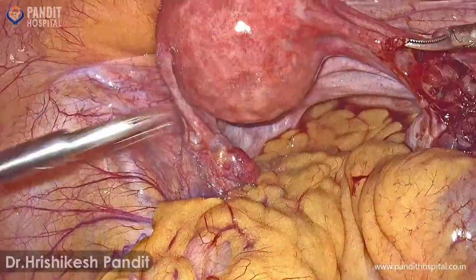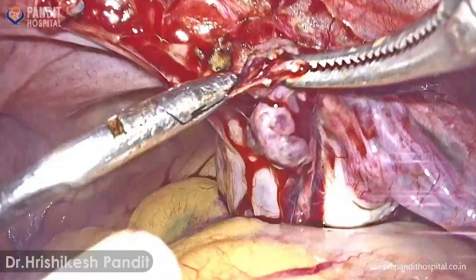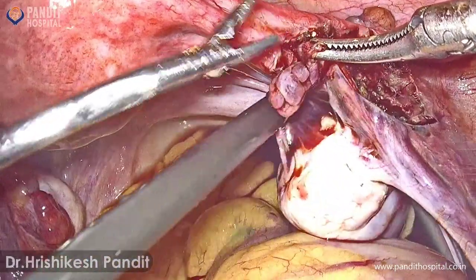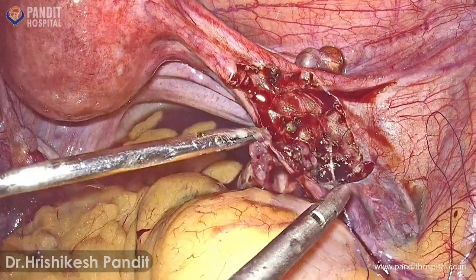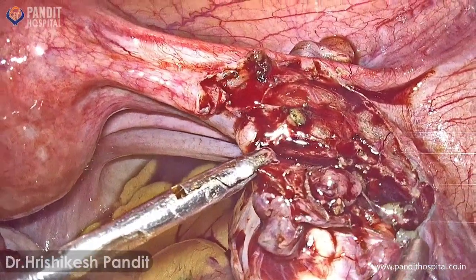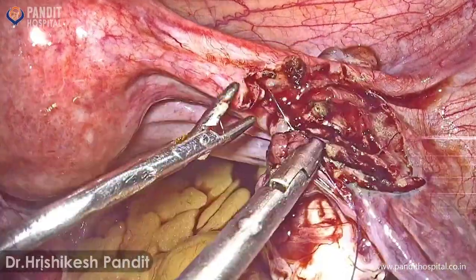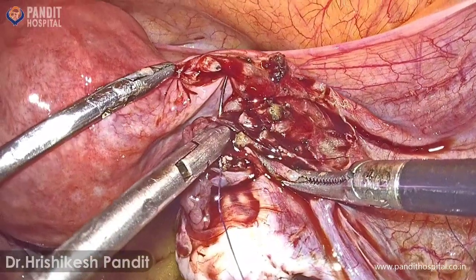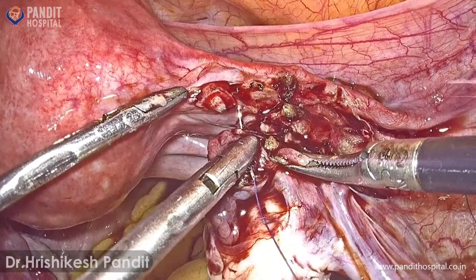As this distal end is quite short, I am not going to check the patency of this end. We will check the patency of the proximal end. When checking patency, the methylene blue should be concentrated so that it stains the mucosa of the tube, which will help us when we are taking the sutures through it. Now we are taking the stay suture through the mesosalpinx angle portion.